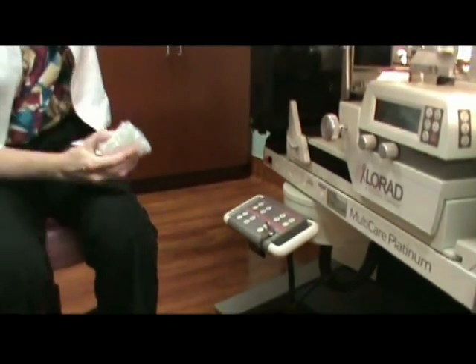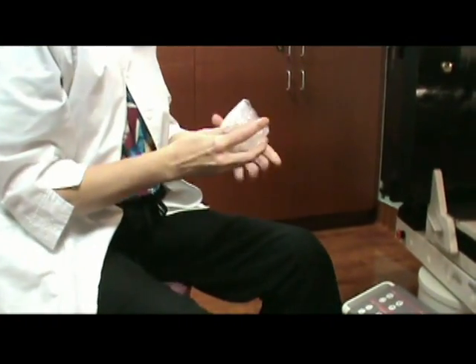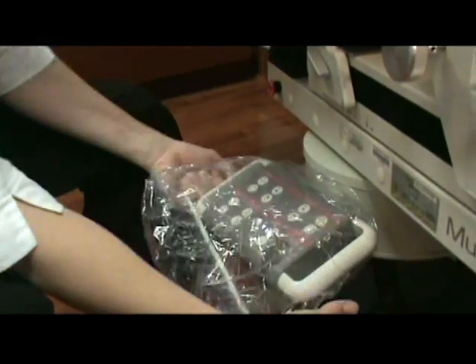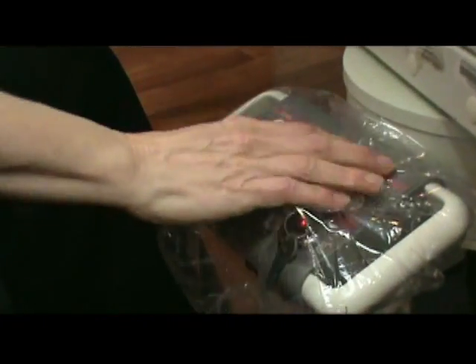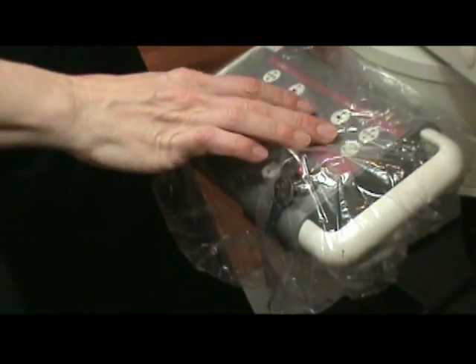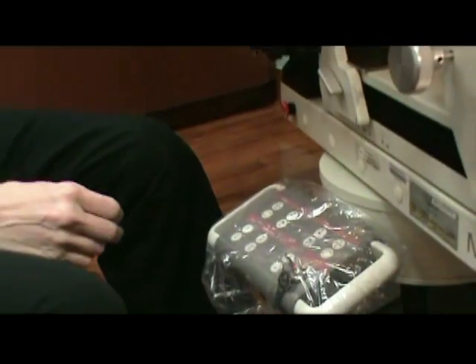We start with the control module. This is kind of just like a big shower cap, and we're just going to stretch this over it. This protects your whole control module from any sort of fluids or anything that you might get on your clothes and reduces the cleanup time.